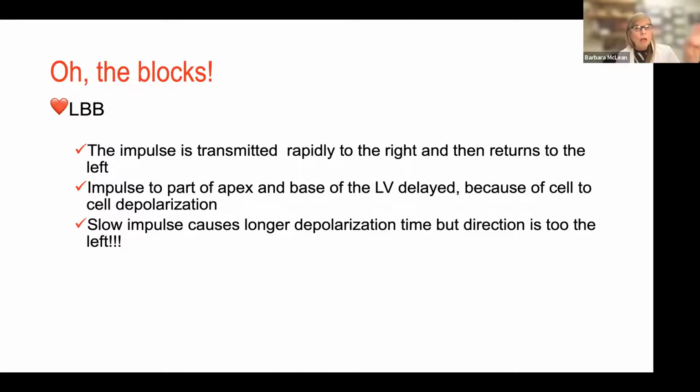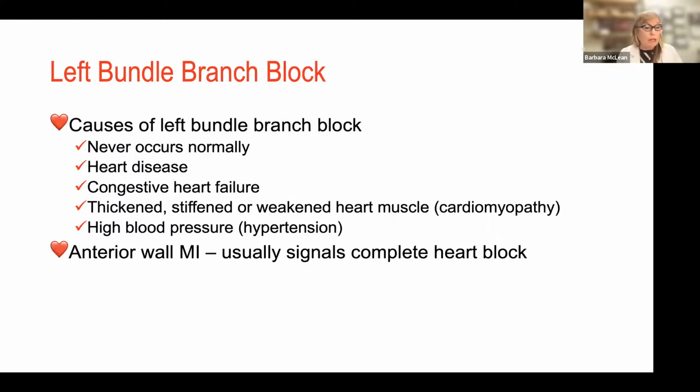Direction normal, time is long. Direction normal to the left, but time is long. And your zone of transition may be normal. It won't be early. It might occur in V4, but frequently it will occur in V5 or V6. So that's really important. Now, why do you even care?